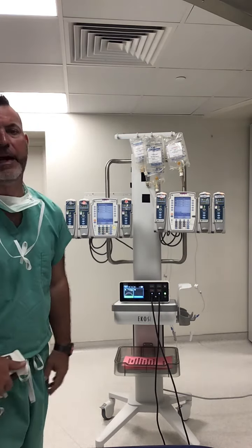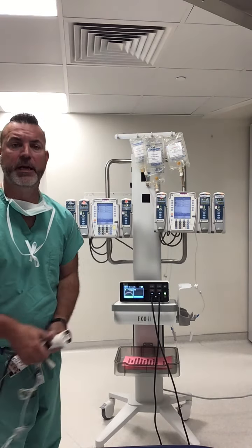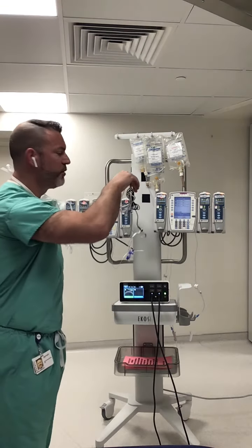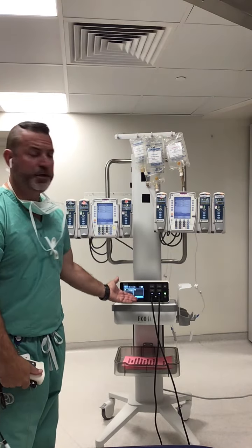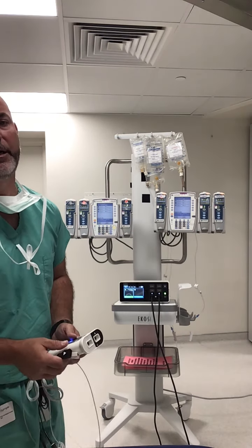So what happens if we lose power? What happens if my machine shuts off when you transport? It's okay. Do you know why? Because this catheter is still flowing. Your fluids are still running through my catheter. The patient is still receiving thrombolysis. We are just not using our ultrasound supercharger, I like to call it. Simply return power and press the green start button. It's okay.